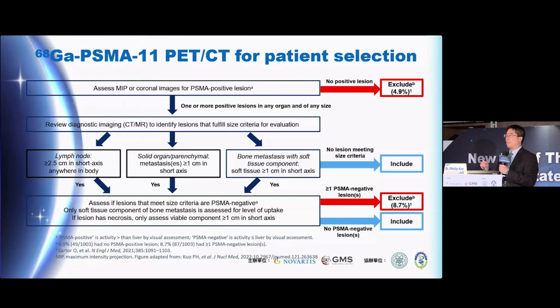First of all, many of you may have heard about using FDG and PSMA PET. Very widely used that way in Europe as well as Australia. The first thing I did was to decide we are not going to do FDG PET at all. Why? Well, there are many reasons, and I had to fight forever because everyone was coming after me to put in FDG PET. I was like, no.